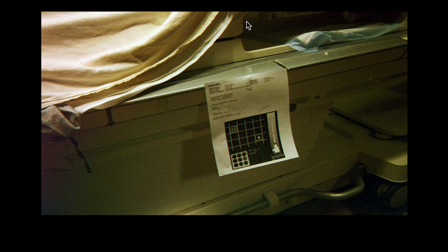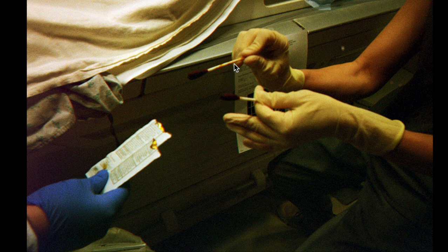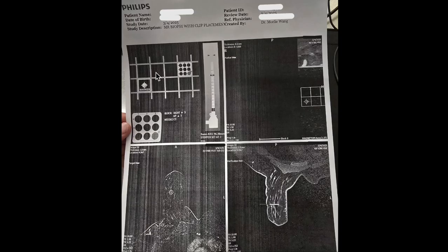So here's the patient lying down, and I tape this right next to where I'm working. I set up my tray like this. I have lidocaine here. I have lidocaine with epi deeper, and then I have my 11 blade. Before I even numb the patient up, I use betadine swabs, 3 of them, one right after another, to clean the square that I know I'm going to. So for example, here's the fiducial, and this is the square I'm using.